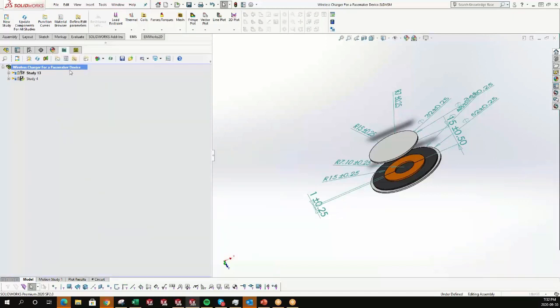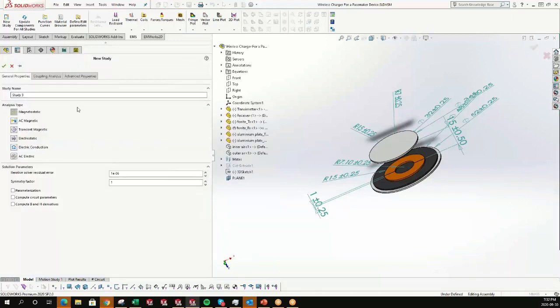A property page will appear, so we now have the study options. We have 6 options: magnetostatic, AC magnetic, transient magnetic, and the 3 modules for electric simulations, which are electrostatic, electric conduction, and AC electric. We have some settings, some factors.